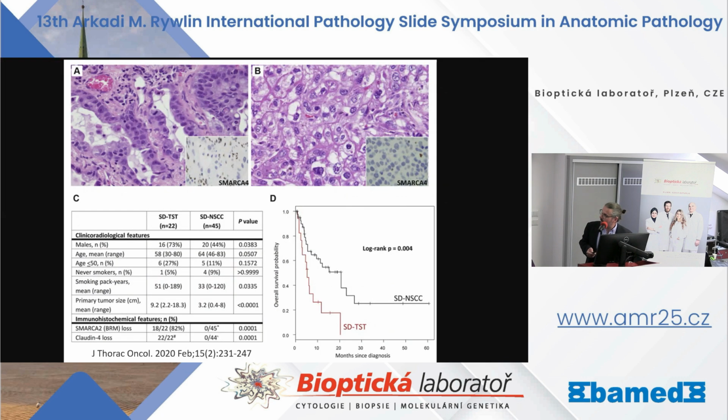In this work, they even compared traditional non-small cell carcinomas with glandular differentiation, squamous differentiation, showing loss of SMARCA4 expression, because up to 5% of traditional cases may have loss of expression, but don't show this sarcoma-like morphology.